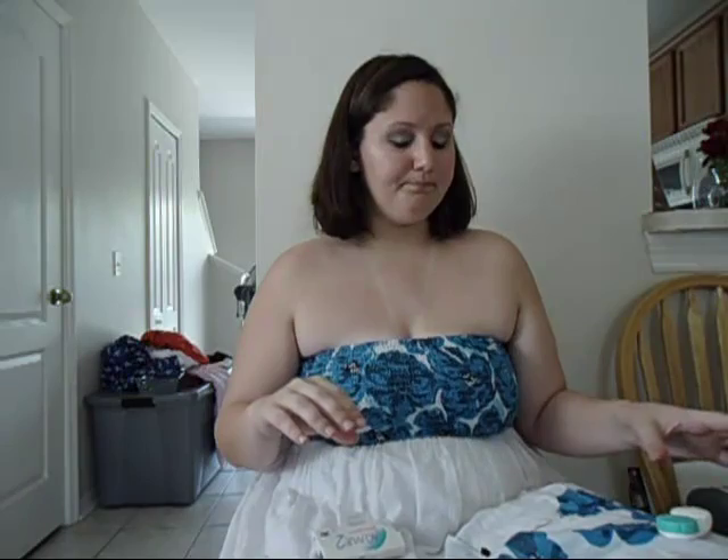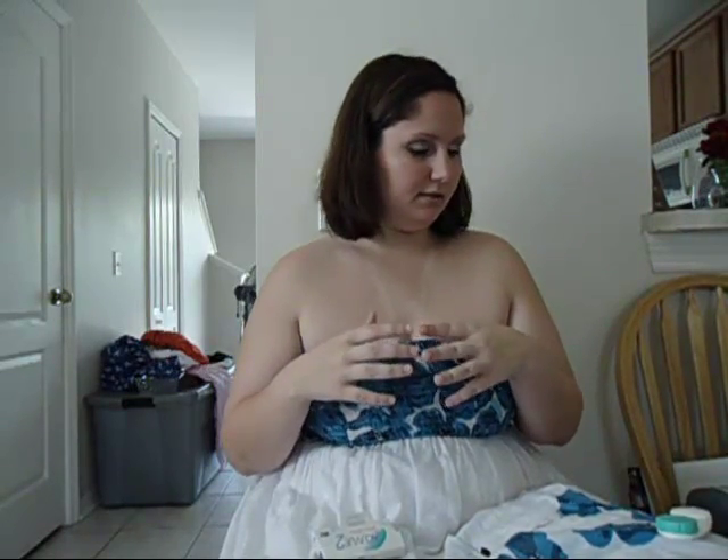You always want to make sure you have clean contact solution in the case. Every time you wear your contacts, you want to dump it out and put new solution in. When you're wearing your contacts, make sure you always have some kind of eye drops with you. I use Vigine — all you want to do is throughout the day, if your eyes start getting dry and red, just put a couple drops in to help replenish your contacts in your eyes.